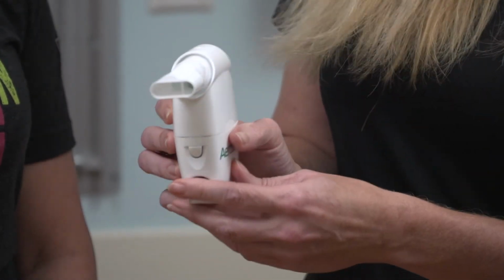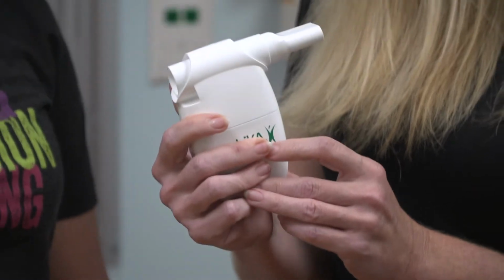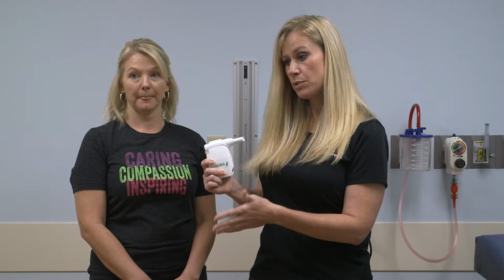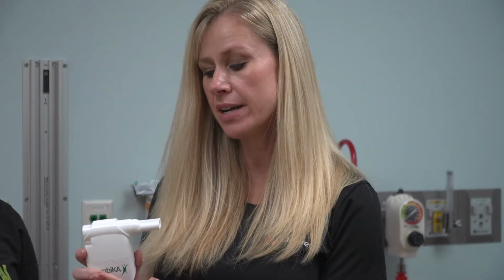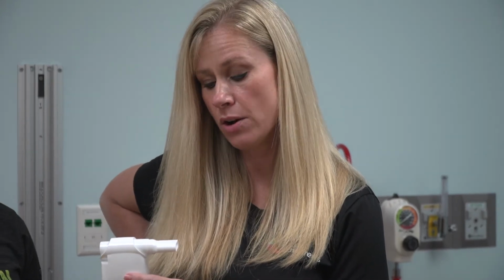So what you want the patient to do, you want them to put this in their mouth. You want them to take in a big deep breath, hold for 3 seconds to allow your collateral airways to open up so air can get behind the mucus and push it out. After the breath hold, they want to exhale into the device with enough force that I can feel it. So I want to put my hand on the back of their lower lungs and I want to feel that vibration. If not, they need to exhale out harder.